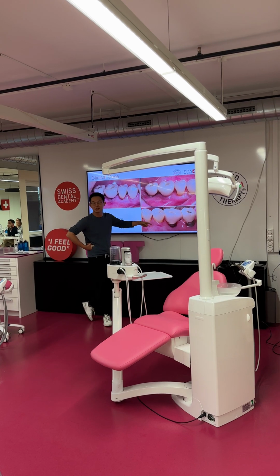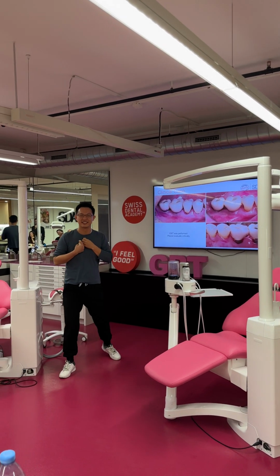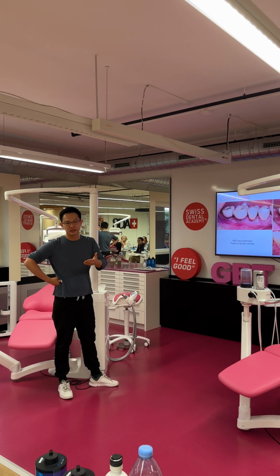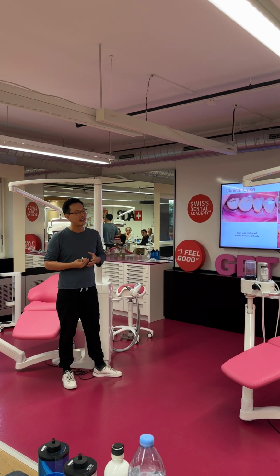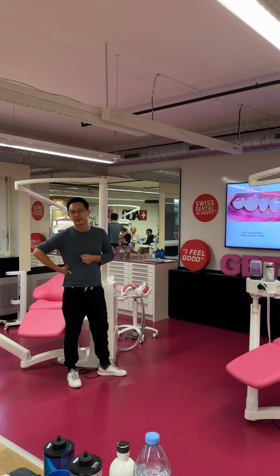These are the real challenges, to me at least. I'm sure you can do a better job. You may do more GBT than I do, although I'm a periodontist. But once again, this is the real challenge and difficulty: if you're doing two-handed dentistry, you need to hold the mirror and then see the disclosing. This is difficult. I'm eager to learn from you in the afternoon to see how we can overcome these difficulties.